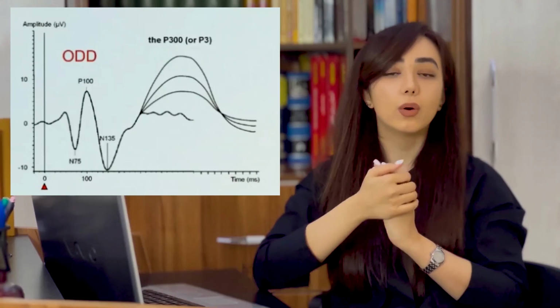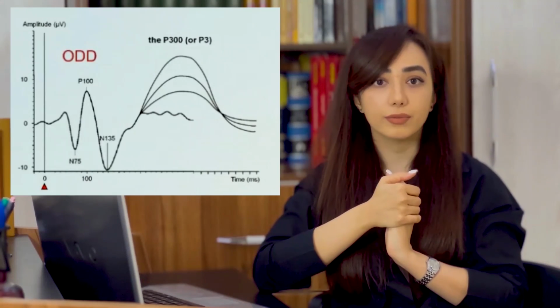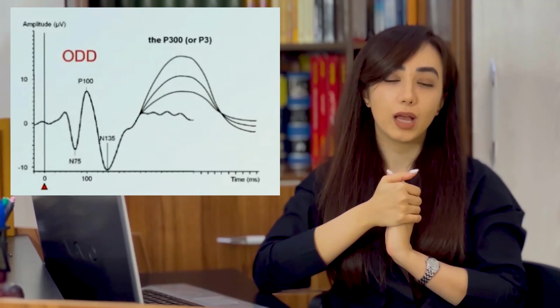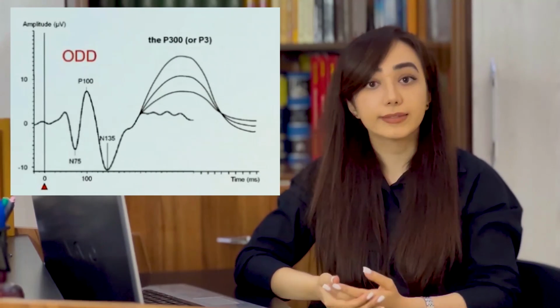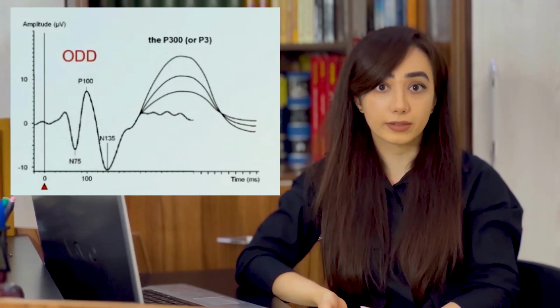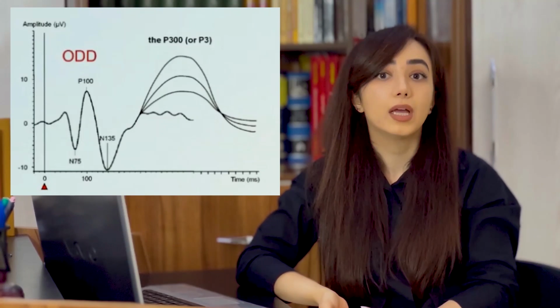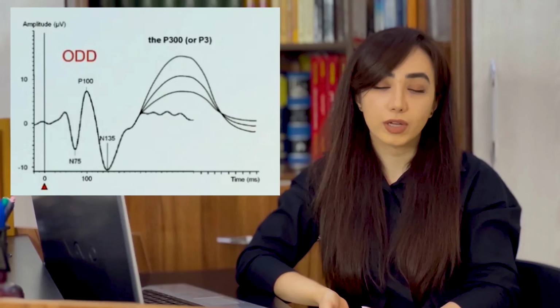And paradigms following this principle are referred to as oddball paradigms. And the more different, attention-taking, and rare the oddball paradigm is, the larger the amplitude of the P300 wave we see.